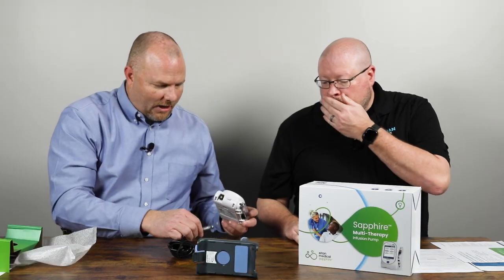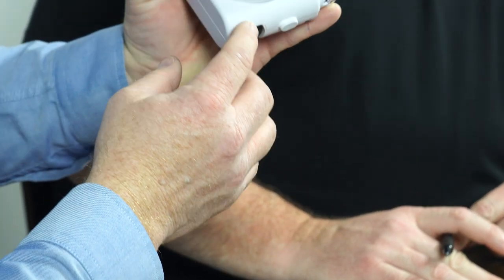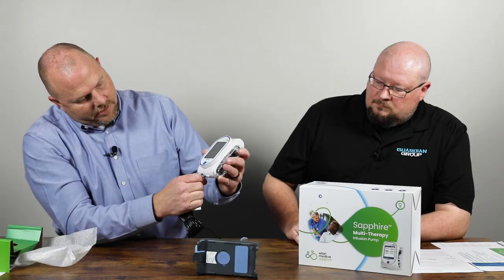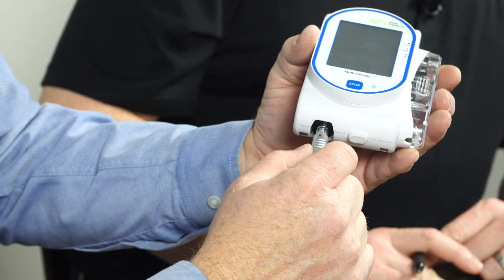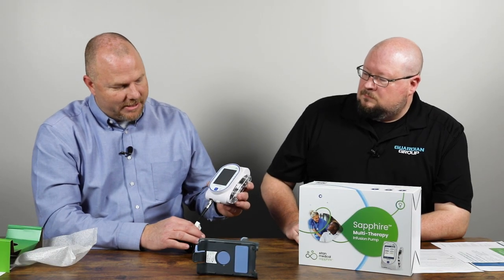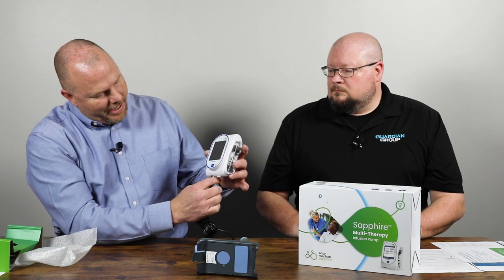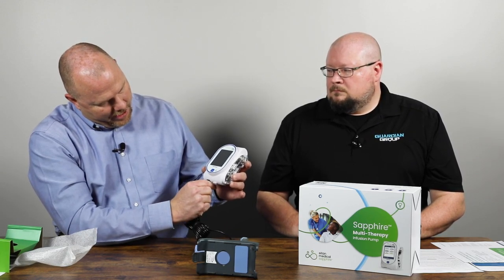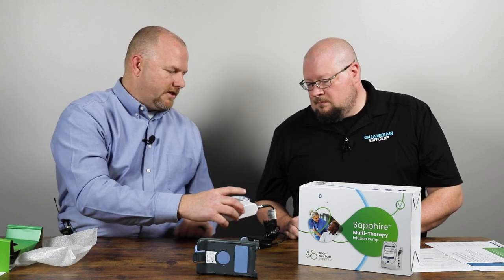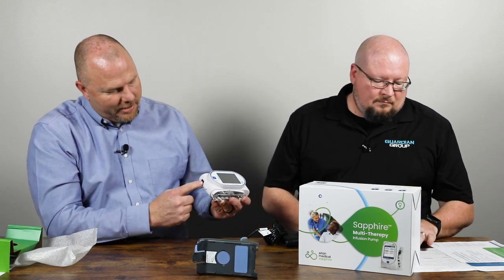There's a little gray area here with a red dot on the charging cord — it's got a lock on the hub. We at Master Medical, through our sister company Renew Biomedical, do a lot of service on the Sapphire pumps. One thing we do see from time to time is damage inside this port. This is designed so that it locks into the charging hub so it doesn't just fall out when upright. To disengage it, just grasp it up high and pull it out. If you yank on the cord, it can cause damage to the ribbon inside this port.